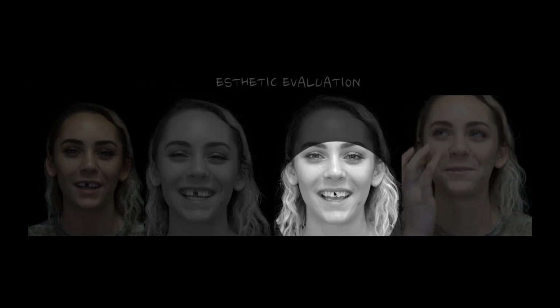The midline lines up somewhat in the middle of her face. The incisal plane is properly correct. And all that is done based on us following the horizontal reference and nothing else. But what we also wanted to prove, and this is part of a lecture that I did at the AACD a few years ago, is what if we just went to a digital world and did exactly what the digital world sometimes tells us to do, and that's follow the interpupillary line. What if we did that?